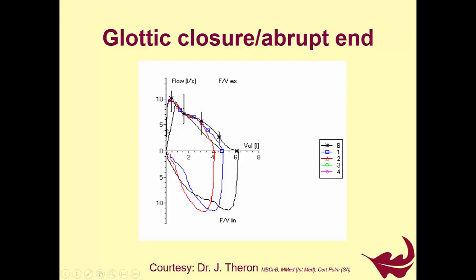Unhesitating start, steep rise, the peak is to the left of 15 to 20% of the forced vital capacity. There are no artifacts on the downward curve, and just see here how the plane comes into land. So there's a plateau, and the curve actually joins the x-axis.